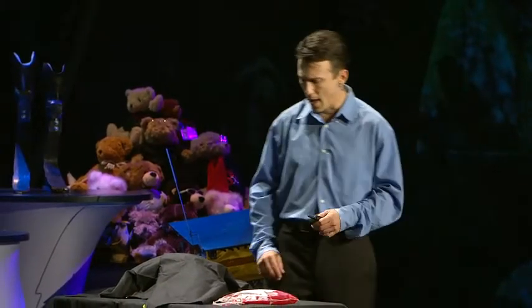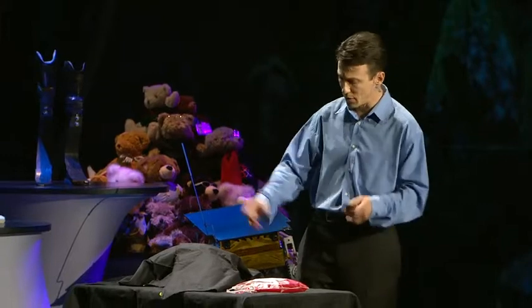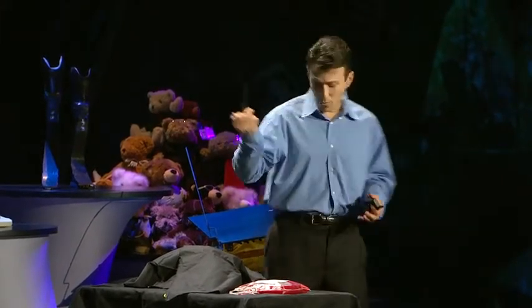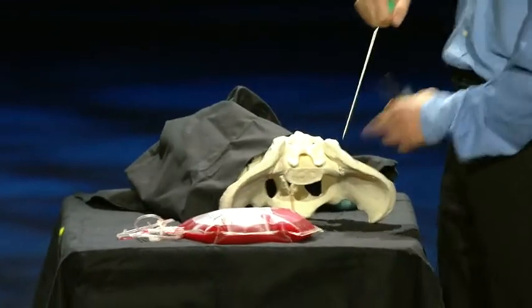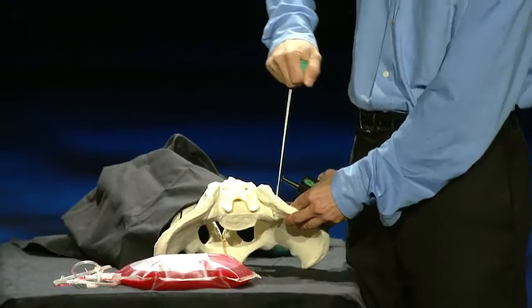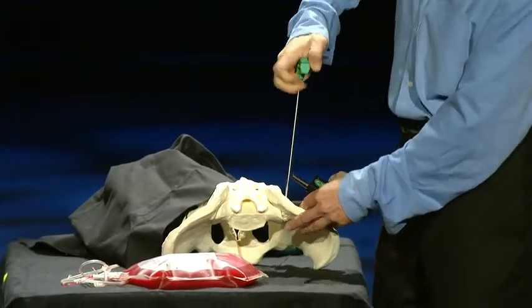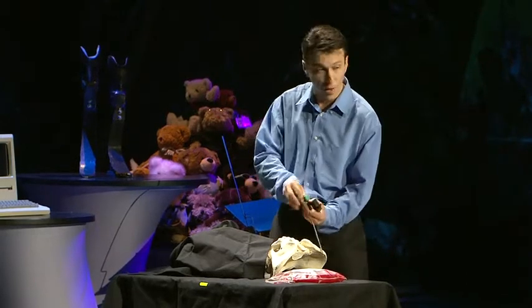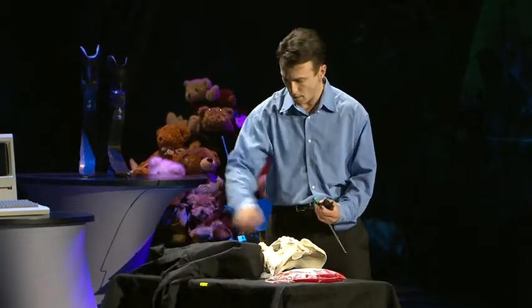Well, we have a whole OR team, general anesthesia, nurses, and another doctor across from me. Bob's on the table, and we take sort of a small needle, not too big. The way we do this is we basically place this through the soft tissue and kind of punch it into the hard bone, into the tuchus, that's a technical term, and aspirate about 10 mLs of bone marrow out each time with a syringe. And hand that off to the nurse.